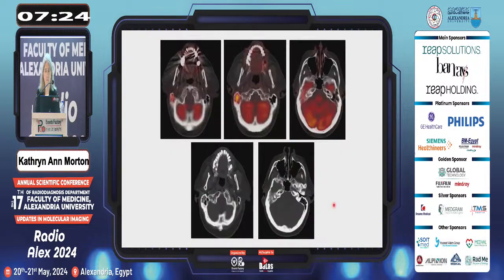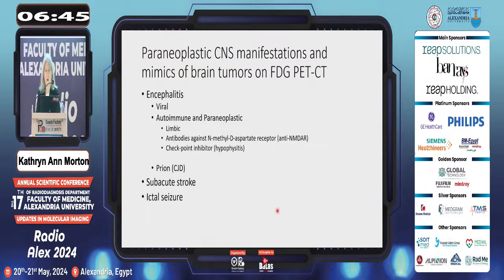This is a patient with bacteremia and pain in the face. There was fluid within the mastoid sinus, and an FDG PET scan showed intense uptake within this region. Also going into the temporal bone here, you can see that this looks a little bit demineralized, and this was thought to be an osteomyelitis associated with this. He had a subsequent resection of his temporal bone, and osteomyelitis was confirmed.